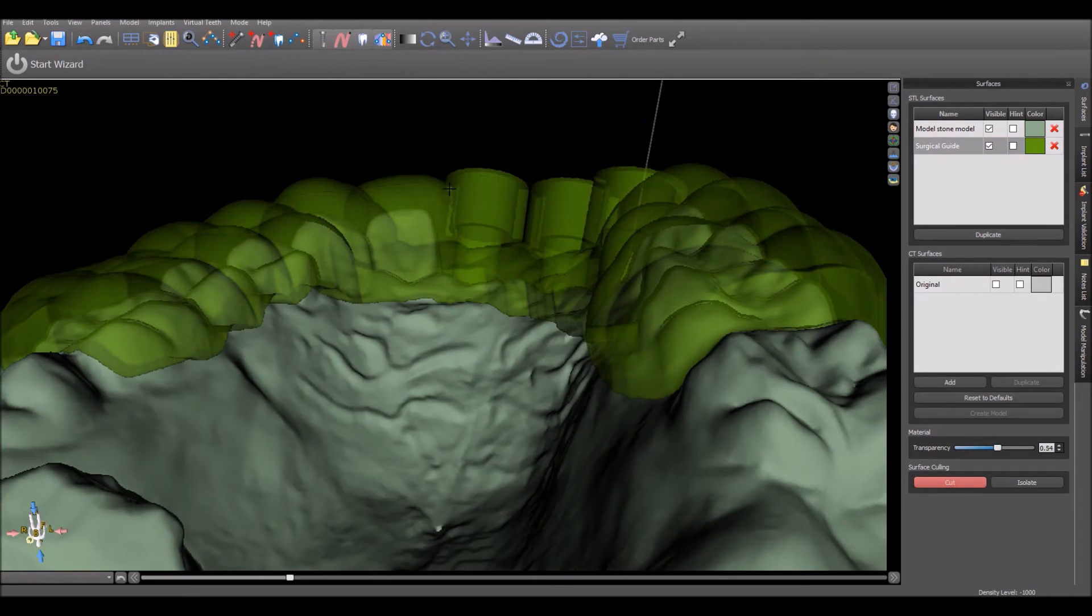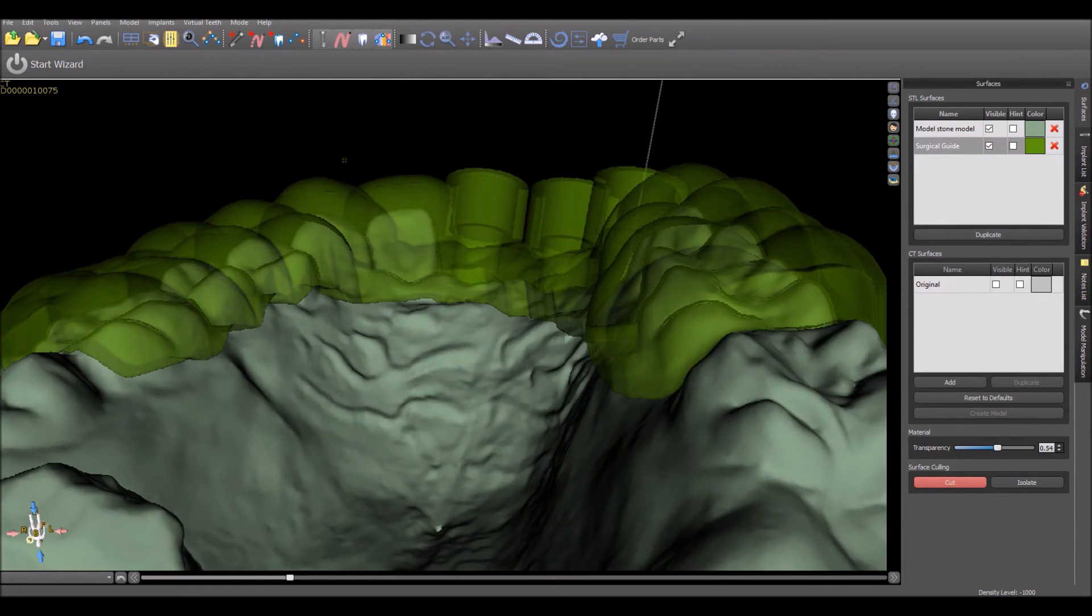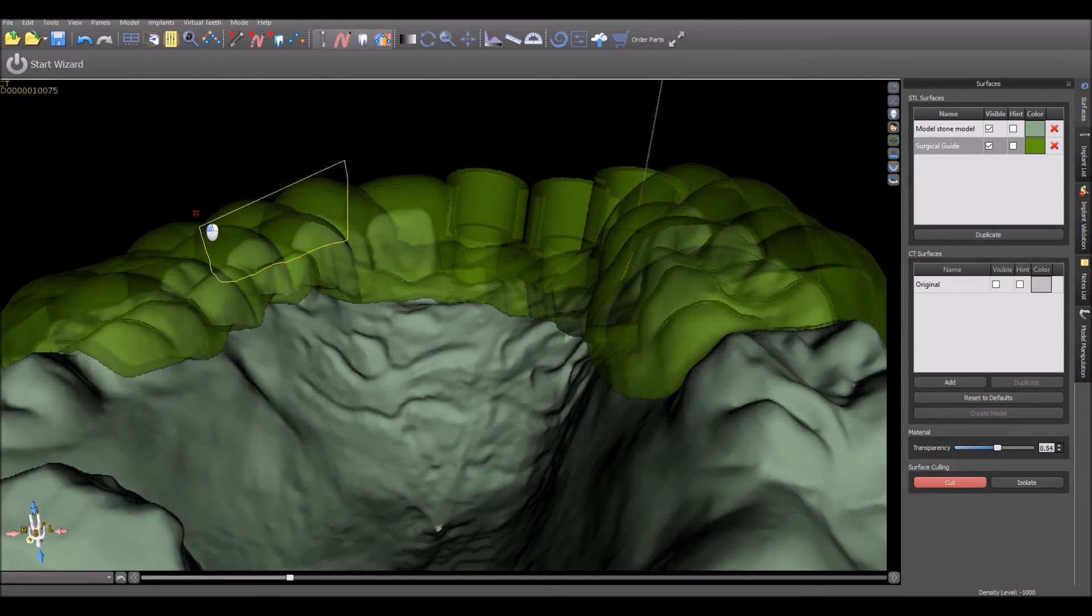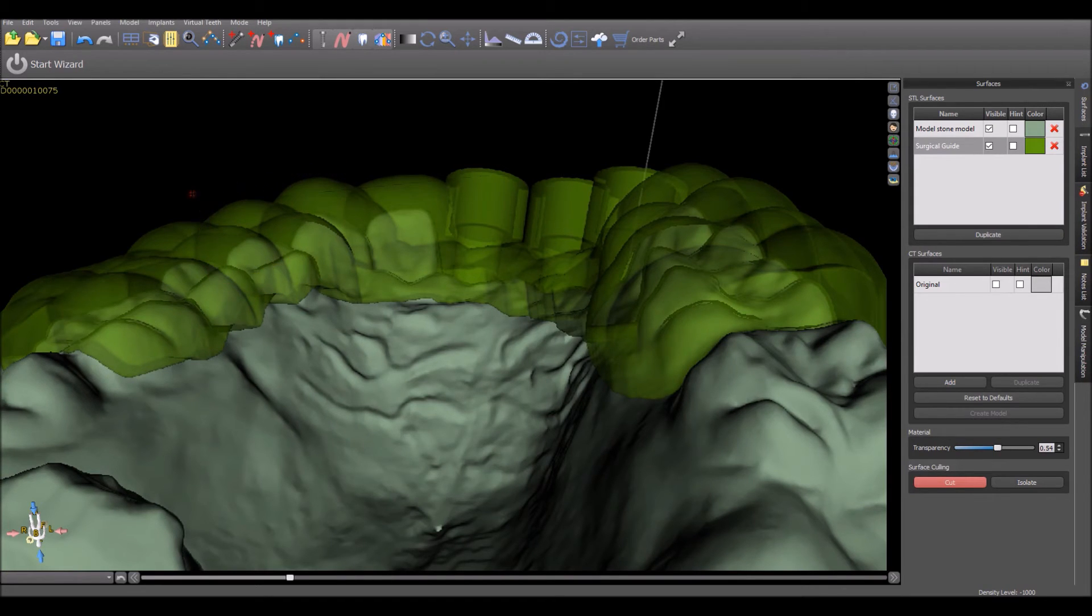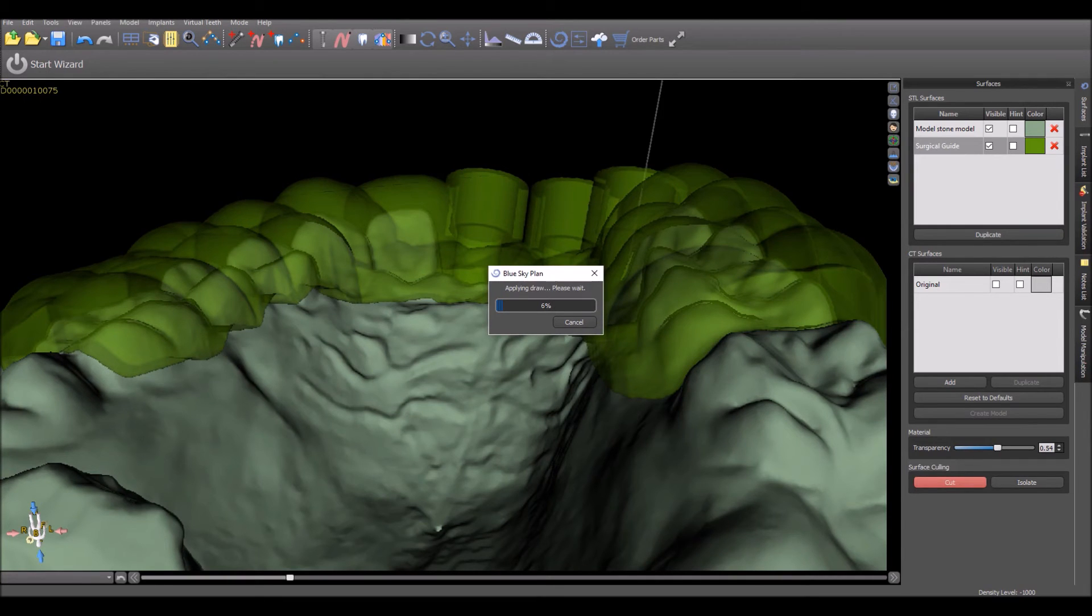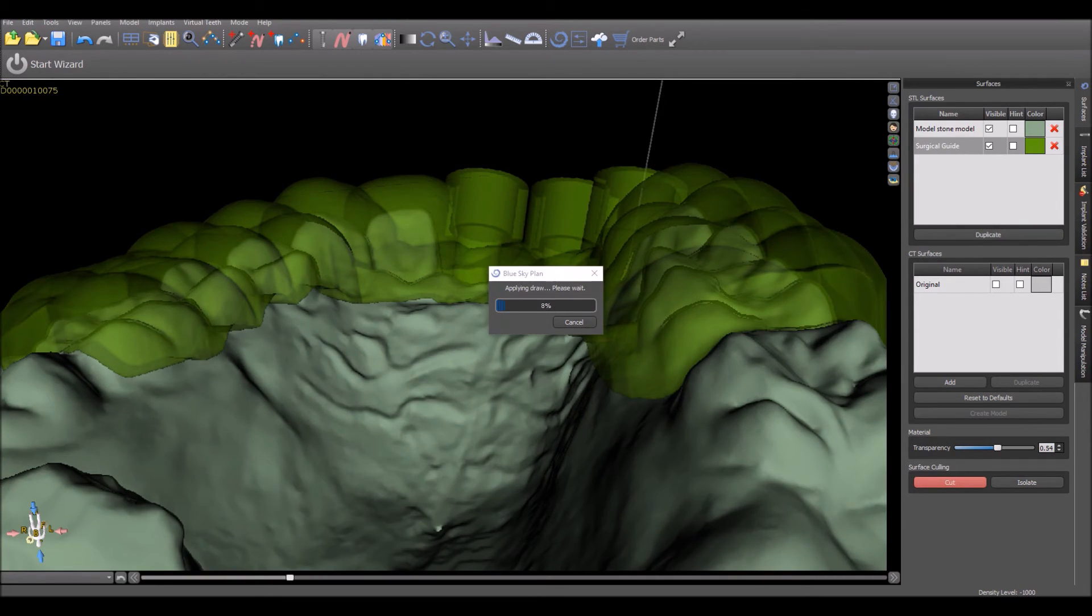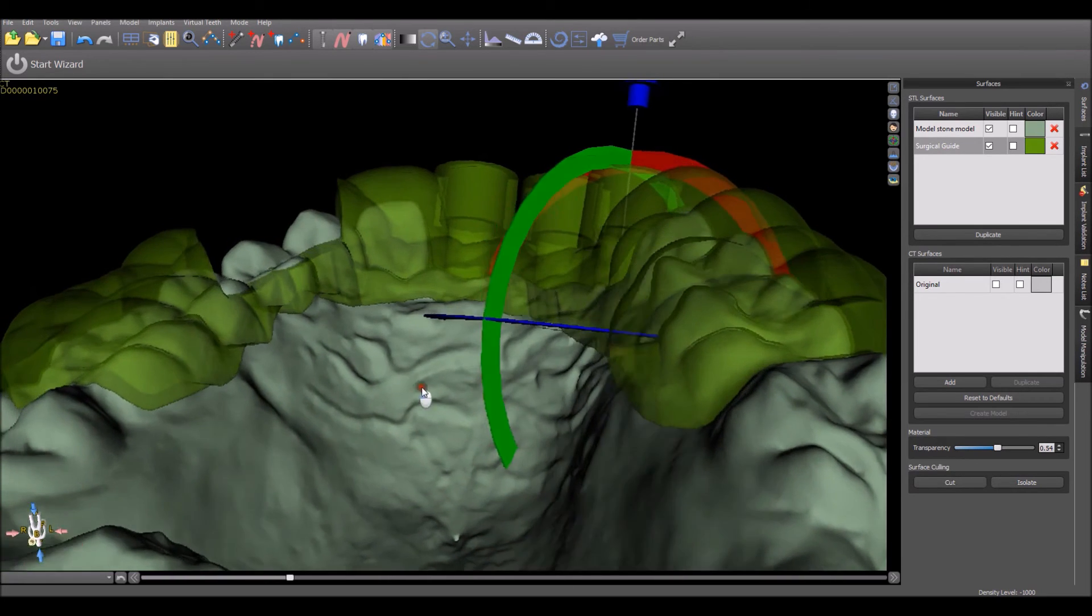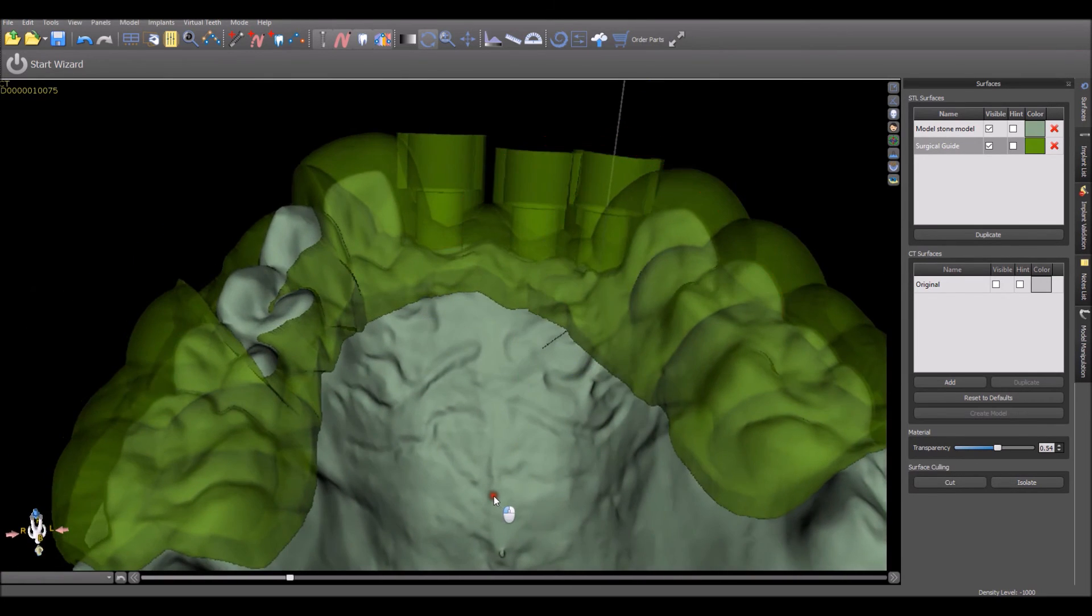And then, you can go ahead and perform the cut, seeing where the tips of the teeth are, and not needing to be concerned that you are cutting any part of the surgical guide that you do not want to be cutting. And here we can see that we have gotten a much better result.